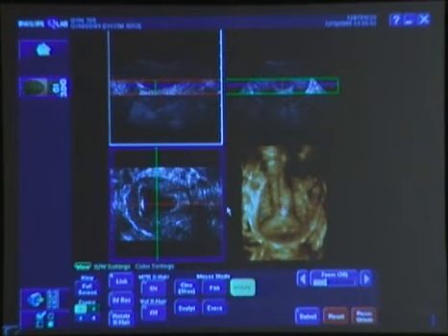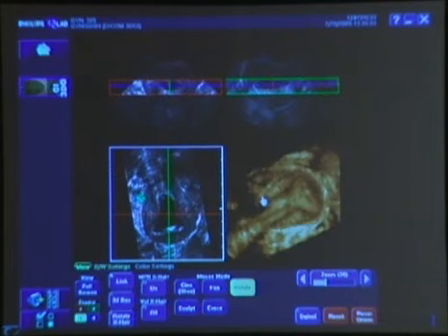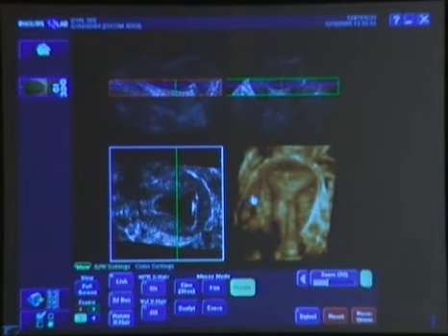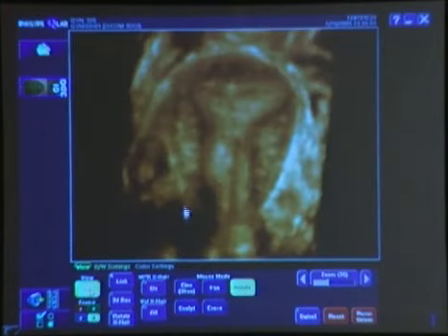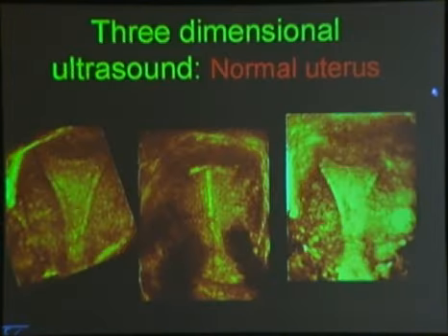And then here the rendering is upside down. Then I'm moving it, hop, not good, so in the other direction, right here. And then I'm magnifying it a little. I'm now clicking it for the whole screen to appear, and now you will see that it is really pretty thick. So that's the thick slice.